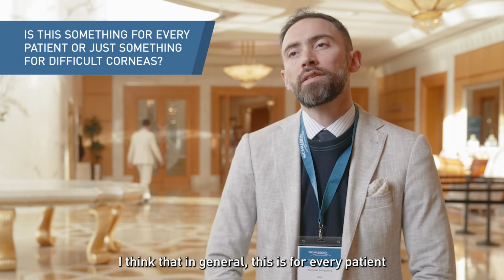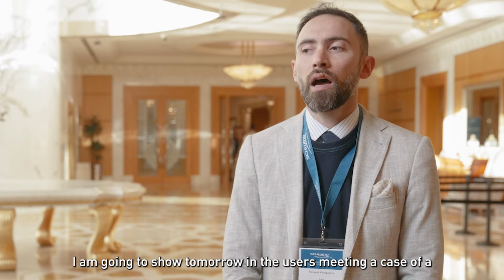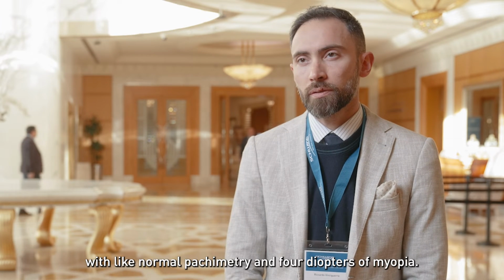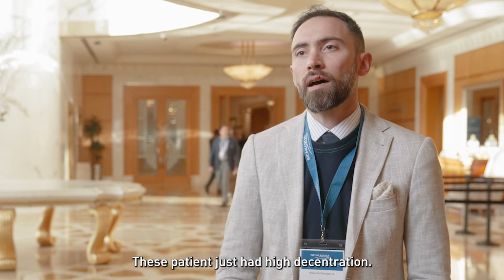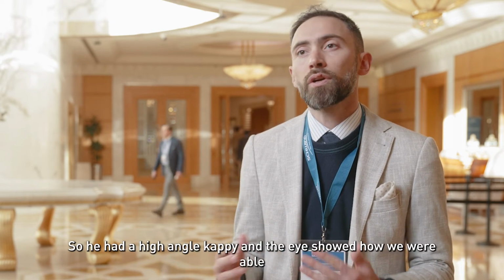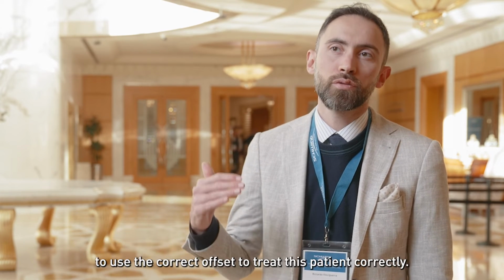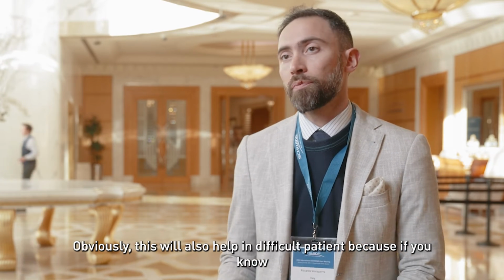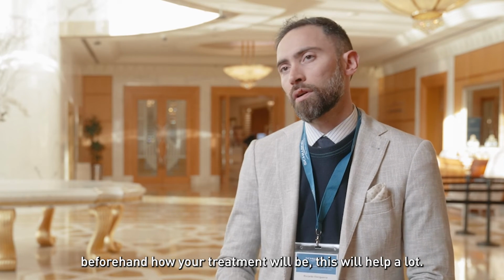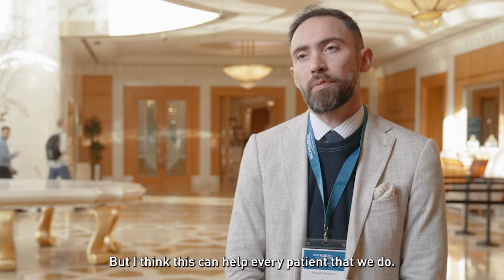I think that in general this is for every patient. I am going to show tomorrow in the users meeting a case of an absolutely normal patient with normal pachymetry and 4 diopters of myopia. This patient just had a high decentration, so he had a high angle kappa. And I showed how we were able to use the correct offset to treat this patient correctly. Obviously, this will also help in difficult patients, because if you know beforehand how your treatment will be, this will help a lot. But I think this can help every patient that we do.